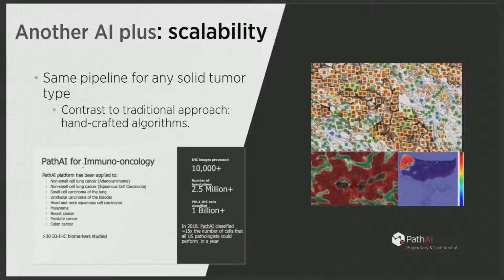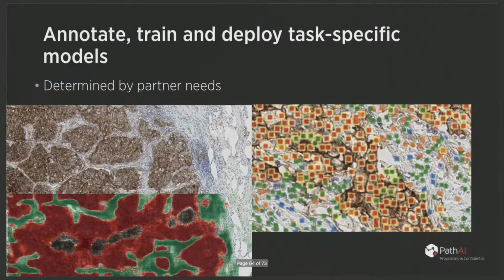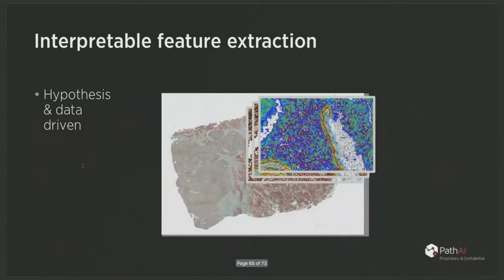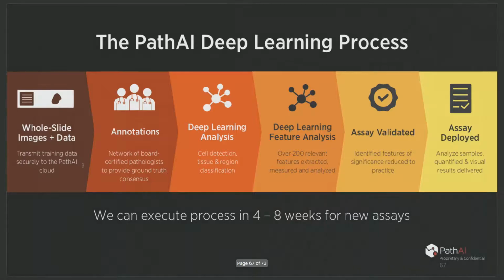And then the beauty of the approach we're working on is it's super scalable, and in theory you could apply it to all of TCGA or other data sets and apply it across cancer types and do things like automatically find artifacts in all of the slides, and do this in a broad way. And then the most interesting part potentially is analyzing the outputs of the models and how they correlate with things like drug response or underlying molecular profiles.